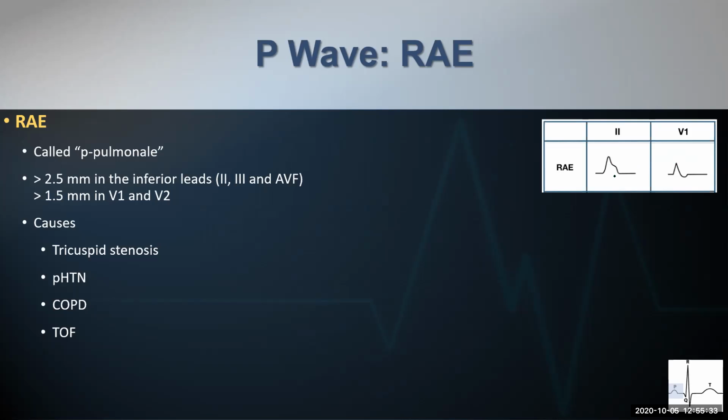Okay. And then for the right atrial enlargement, it makes sense that if I said the first portion of lead 2 was the right side and the left side was the second portion, then if we're thinking about right atrial enlargement, we should see it be predominantly positive on that first deflection.